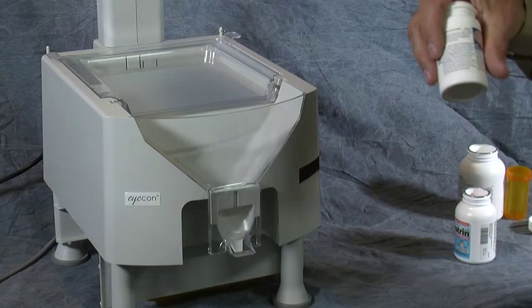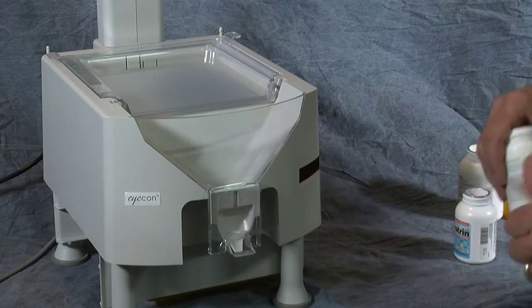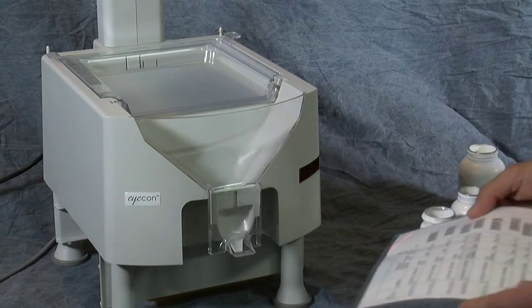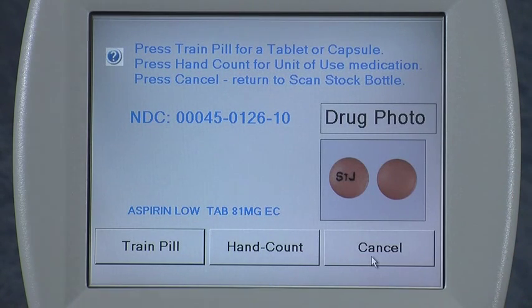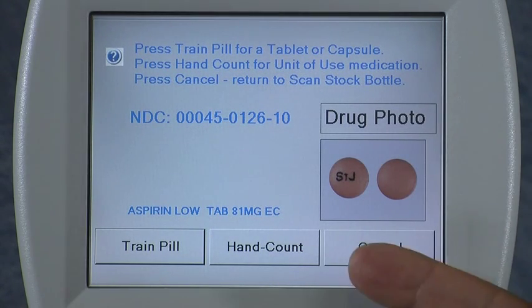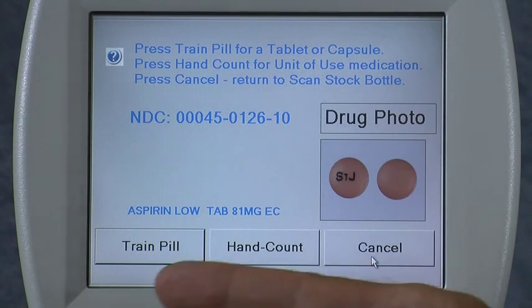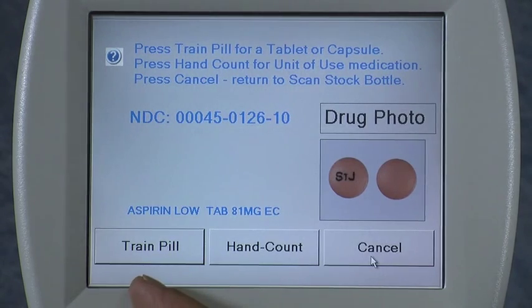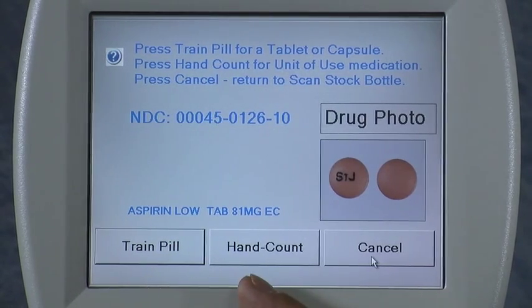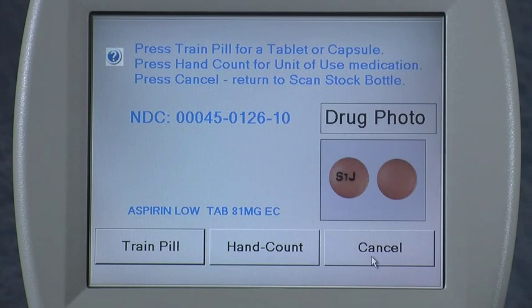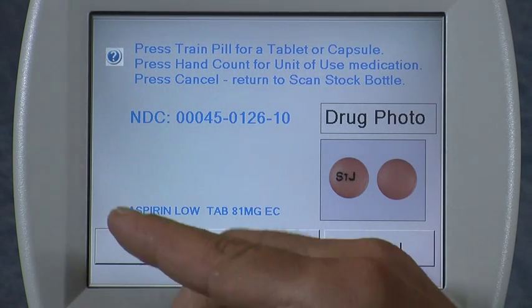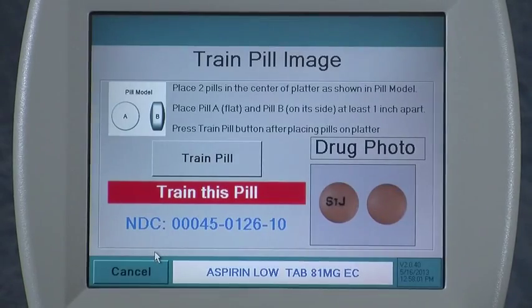Here, in this count-only mode, I'm simply going to scan my stock bottle, and in this case it comes up and says: train pill or hand count. So it needs to know — is this a countable item, a pill that we can count on the ICON, or is it something like a syrup, syringe, ointment, or cream? If it's one of those, you press hand count. If it's an actual pill, you press train pill.